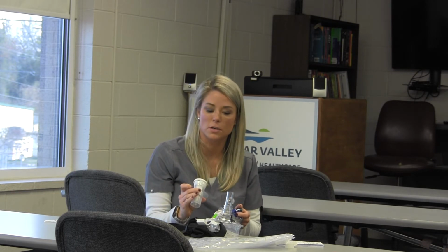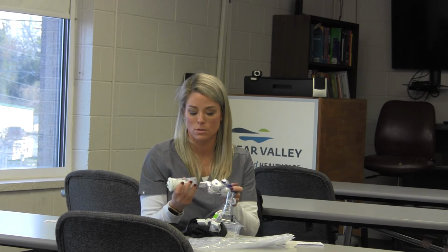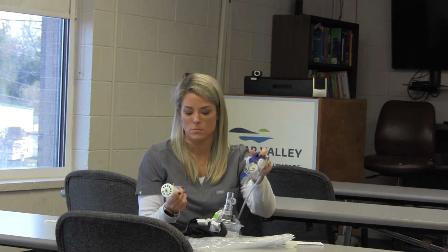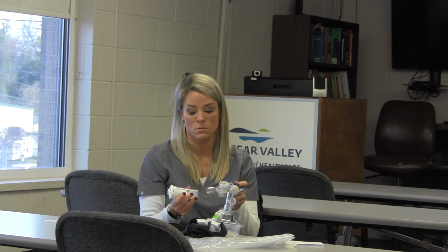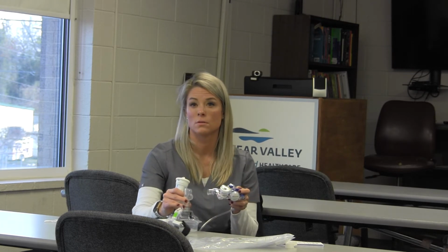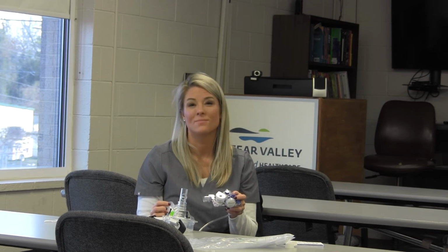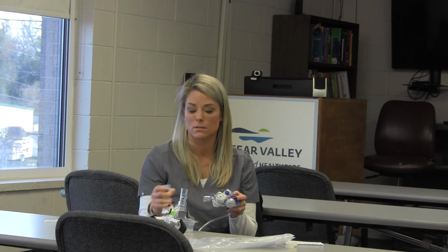How would this work? Because I haven't used this one. This should just be standard. Will this thing go into the bottom of the T? Yeah, so that goes on that side, and there should be an elbow to connect to the bottom side of the T. Either that or we need the squishy blue thing. This blue adapter. Squishy blue thing.